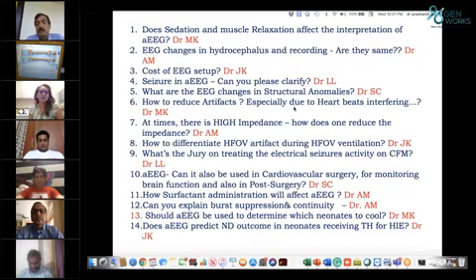So you should be running your ECG with your EEG, and whenever you have an abnormality in the EEG which is because of this, you will be able to see that it correlates with the QRS pattern. That's how you will be able to differentiate whether it is something abnormal in the EEG or it is due to artifact because of the ECG. So that's how you will be able to do that.